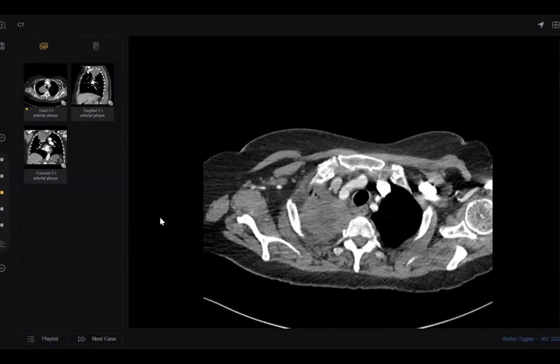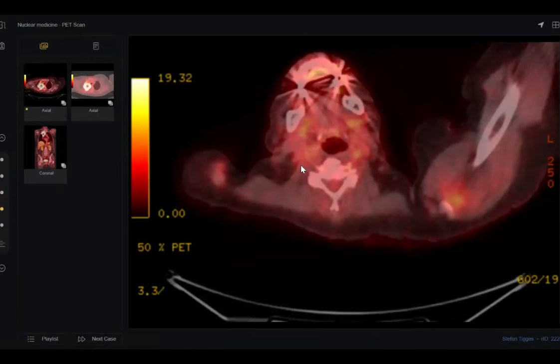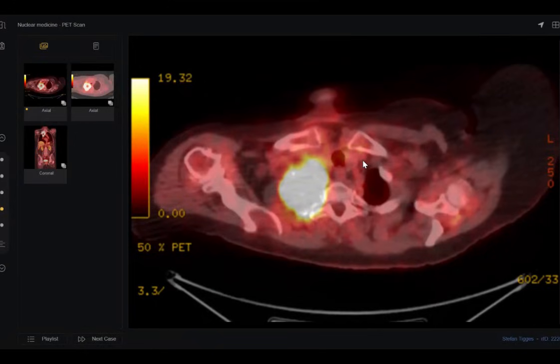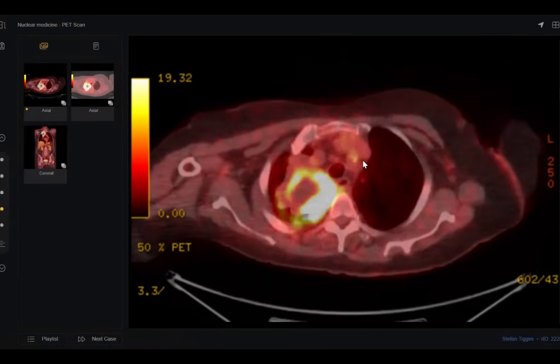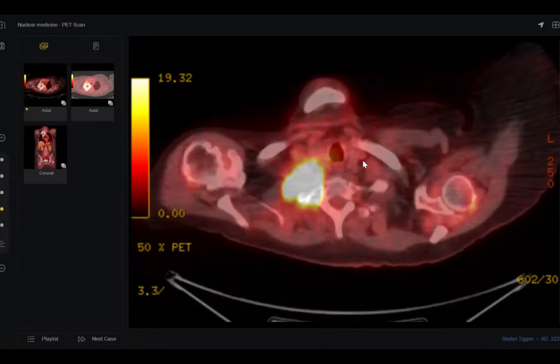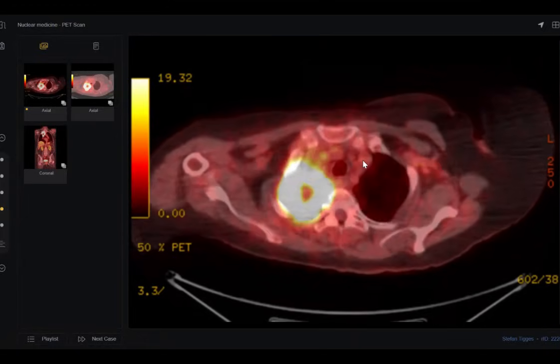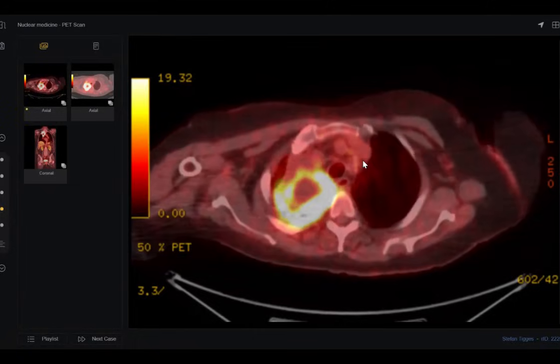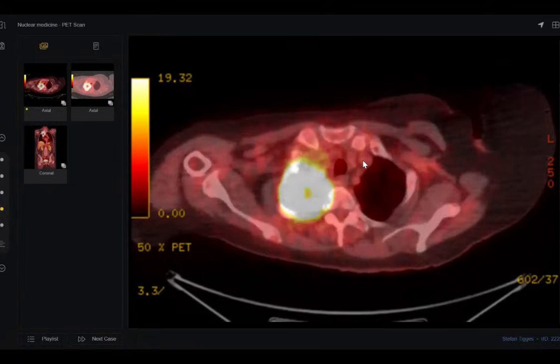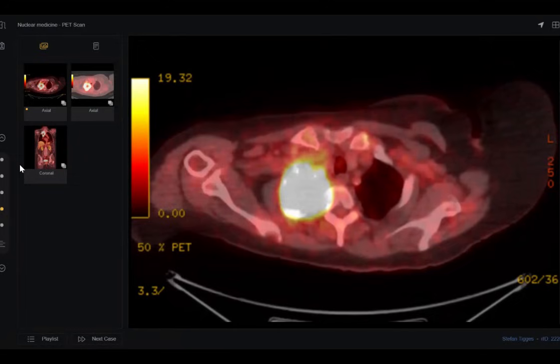What about small cell? If squamous cell carcinoma will not take uptake... Okay. Let's see. What do you think? Sir, it's taking avid uptake, sir. Yeah. Why should we do PET CT for any chest tumor, any lung bronchogenic carcinoma? Why? Sir, I'm not sure, sir.